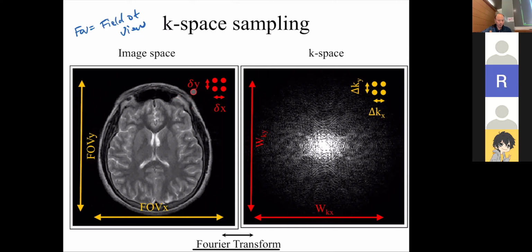And then the other thing I want to specify is delta X, delta Y. This is my resolution. Like, what's the size of every pixel in my image? Maybe it's 2 millimeters, maybe it's 3 millimeters, okay? Obviously if it's 10 millimeters, that's very coarse resolution, and if it was 1 millimeter, that'd be finer resolution. It's the same thing as when you buy a TV: what's the resolution of your screen? So that's what you specify. There are 4 parameters that you specify, at least for these basic parameters.